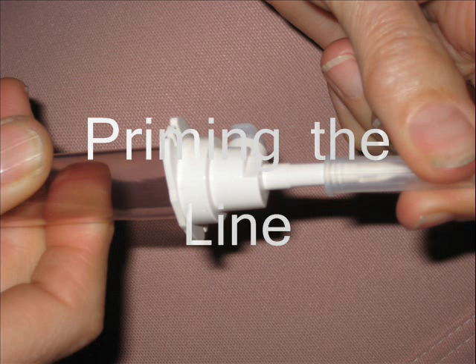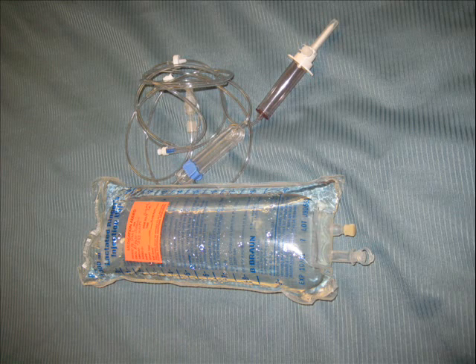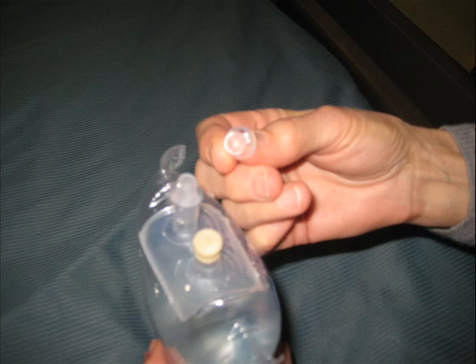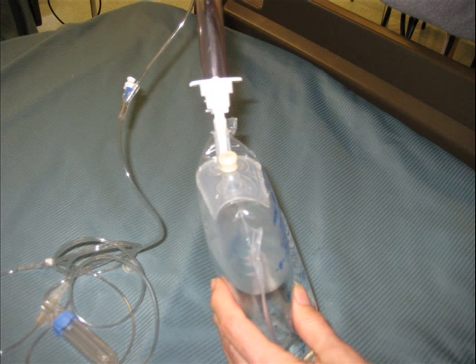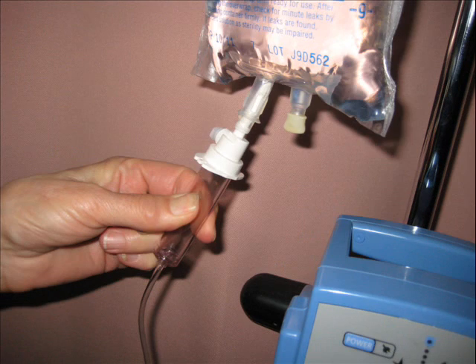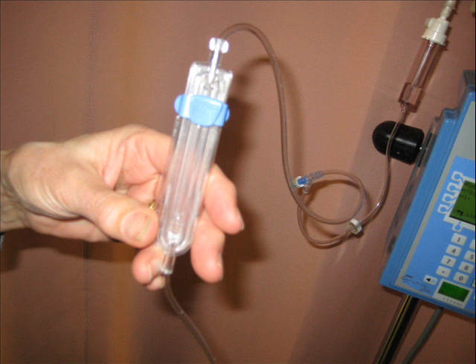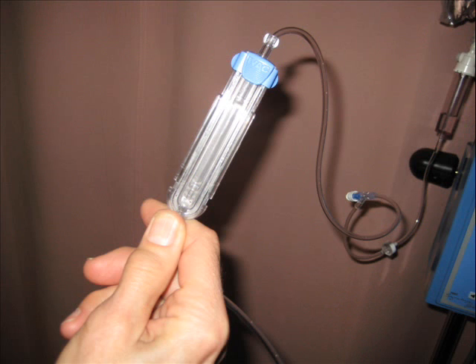To prime the line, we first have to take the cap off, making sure we are maintaining sterility. We need to be sure that we have clamped our cassette, take the bag and open it, spike the bag. Then we turn the bag upside down on our pole and press the chamber to put fluids inside so that it is half full. We still have our cassette closed at this point.